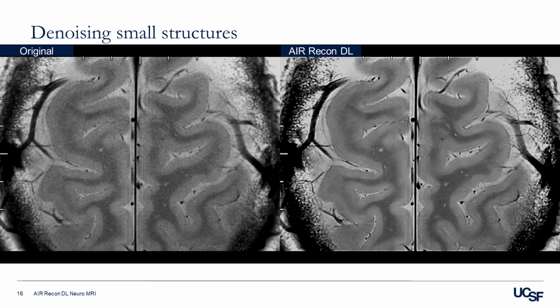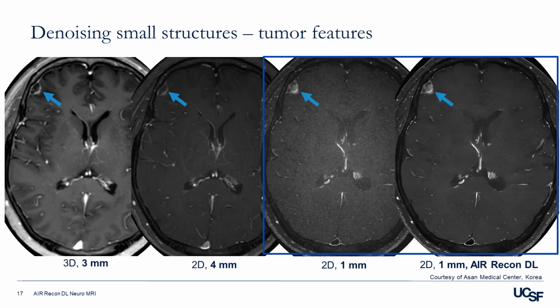So if the initial enhancement or change in image quality is perhaps a little bit too much or something that you're unaccustomed to, you can dial that in and slowly build it in as you gain more experience with this tool.